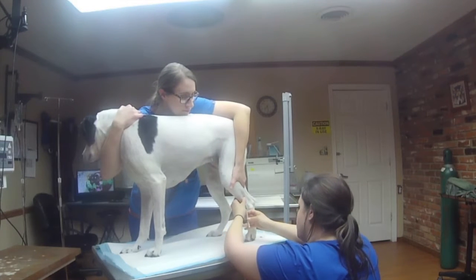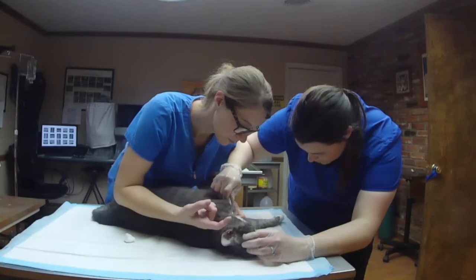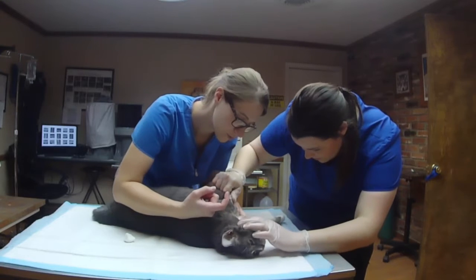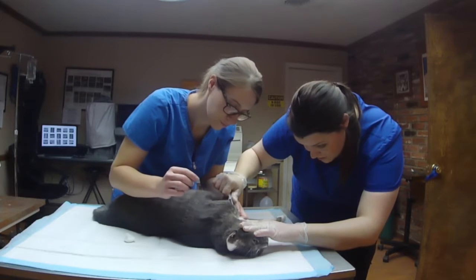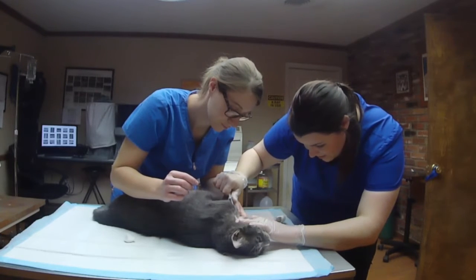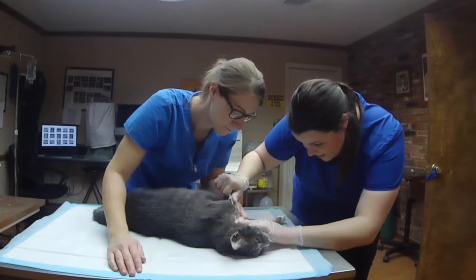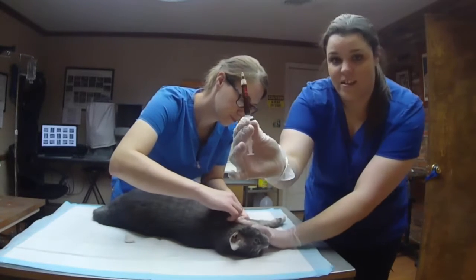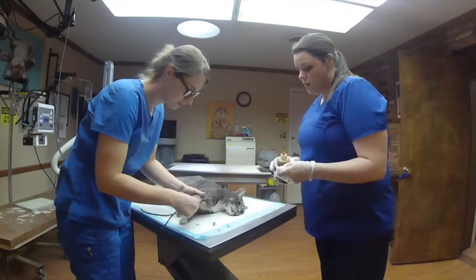Let go. Beautiful. And that is how you draw from the saphenous lateral vein. Patience is a virtue. You just won't believe it. Golden? Okay. And that is how you draw blood from the jugular vein of a cat. That's how you draw blood on a cephalic vein of a cat.